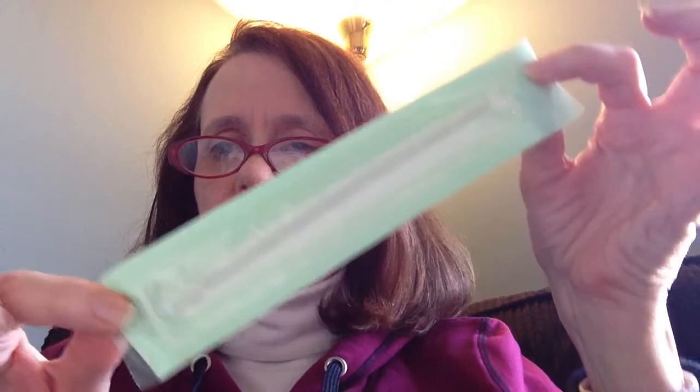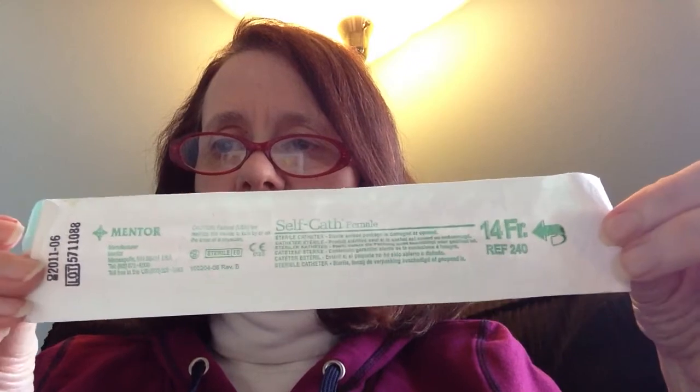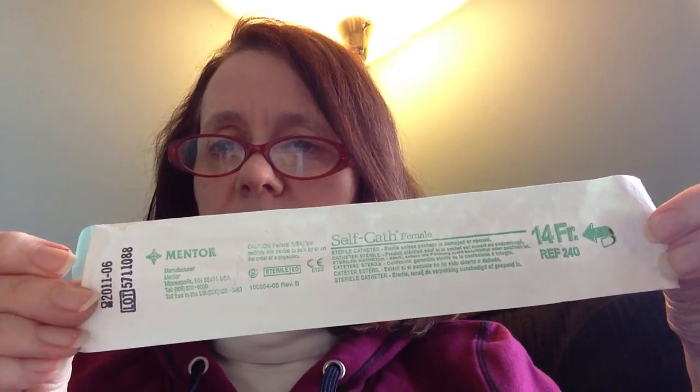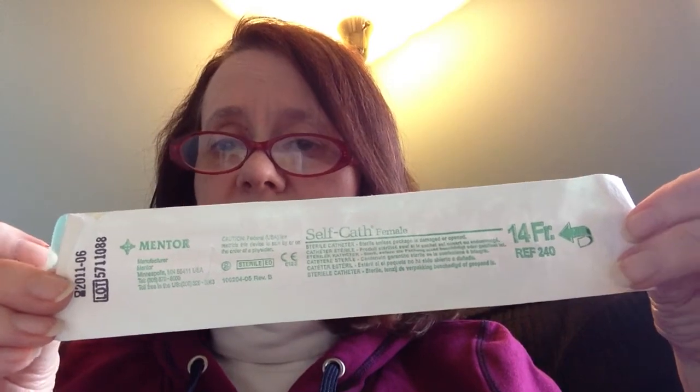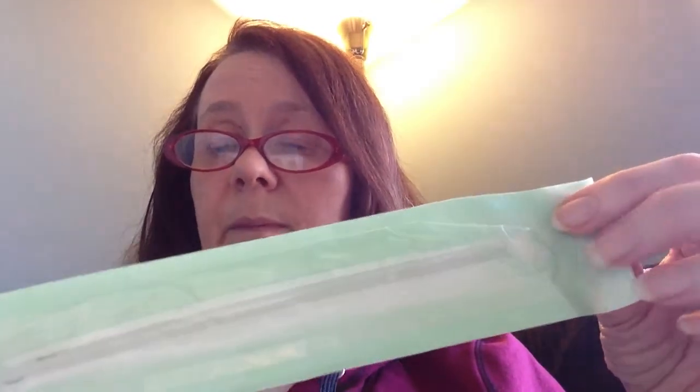Here's what I use, first of all, just to self-catheterize. If you have retention like I do, and you need to catheterize yourself at home, these are the catheters. You can see how they're only 6 inches in length, and there's what they look like on the back. They're made by Mentor. This is what's known as an intermittent catheter, and I usually buy them by the box, actually usually by the case, because I use that many.